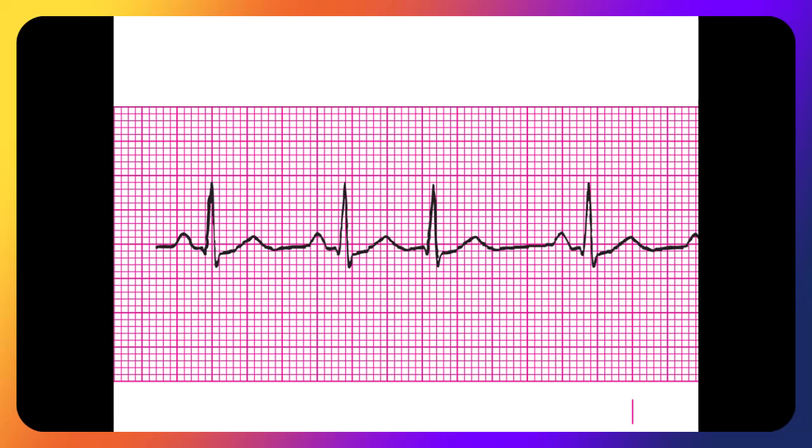What else do you notice? First of all, if there's no P wave there, there's no PR interval. Braden, if you're calling that a P wave, what would you estimate the PR interval is? I would estimate it to be one small box, which is 0.04 seconds. Much, much shorter than what we would see in here.